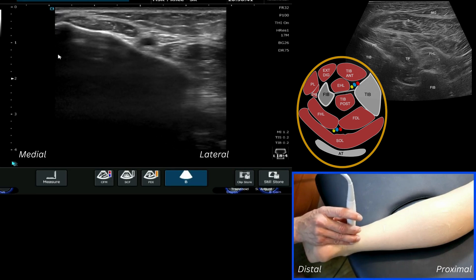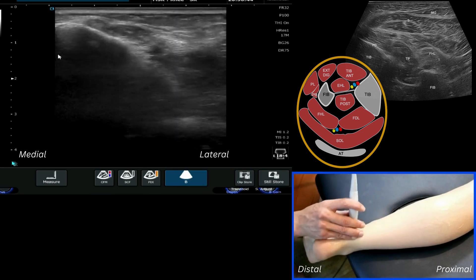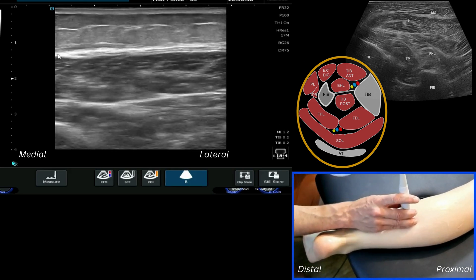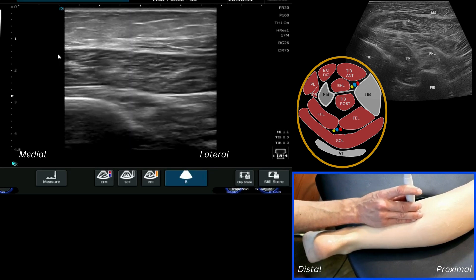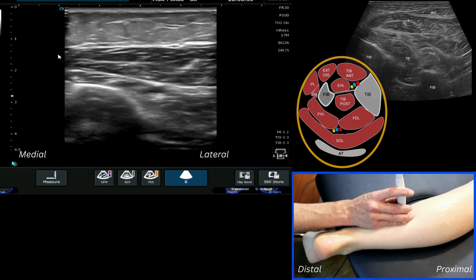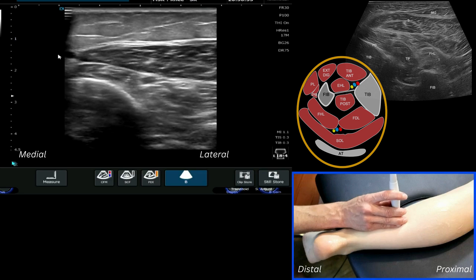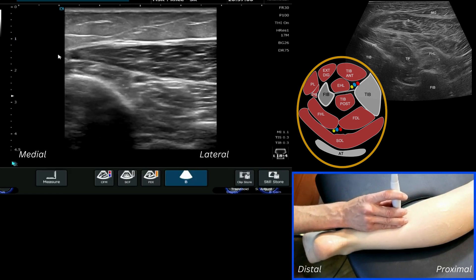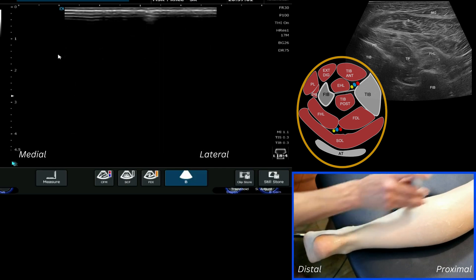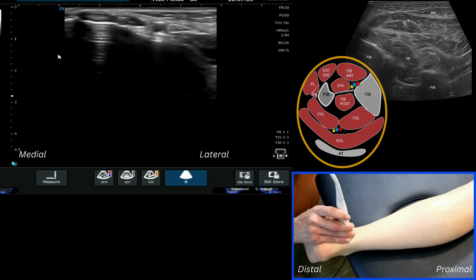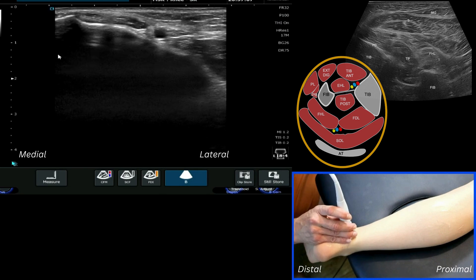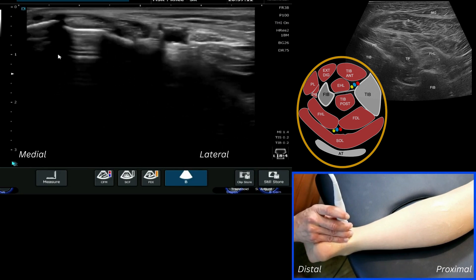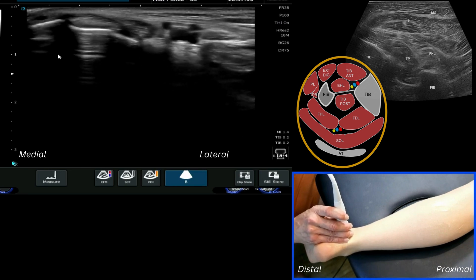When trying to identify this region, it's quite similar to areas like the hamstrings — if you immediately put your probe onto the calf region it's quite difficult to identify which muscle groups are which and which tendons belong to which muscles. So what I'm going to suggest is we start off at the tarsal tunnel. We can reduce our depth on the image, which means we can see the tendons very clearly at this point.